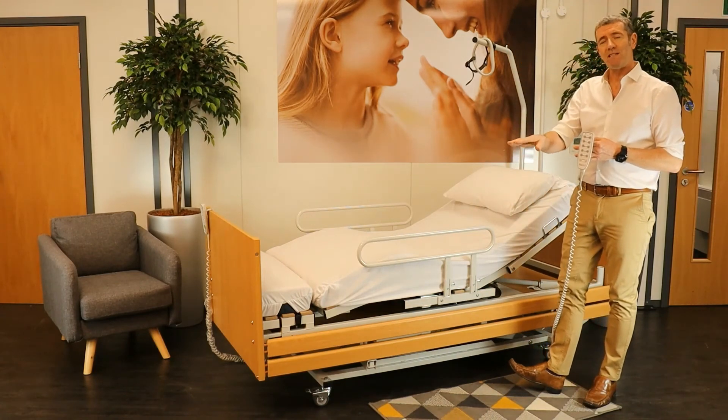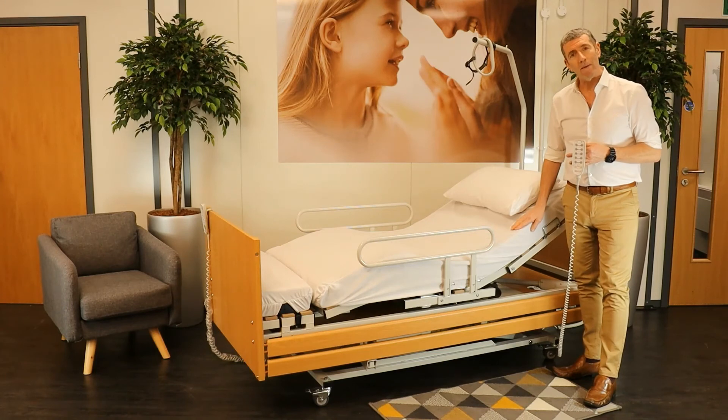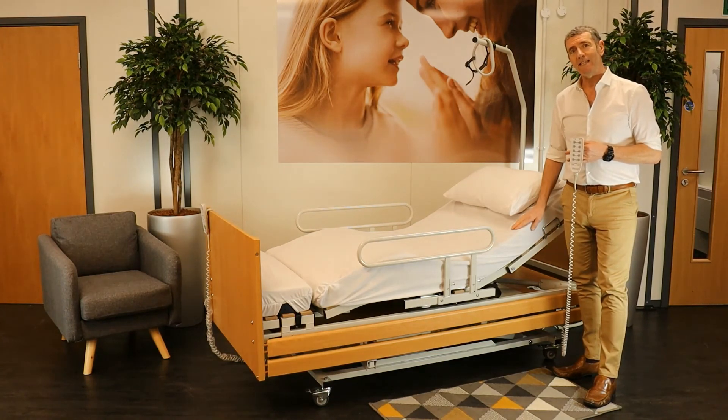We also have the foot block here at this end, and that is there for the feet and the heels to rest. So the Rotopro Rotational Chair Bed — helping people to get in and equally to get out of bed.